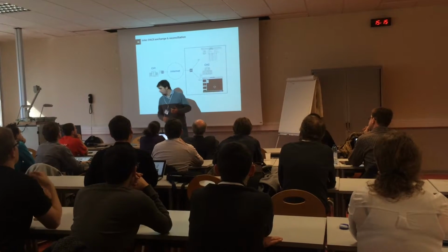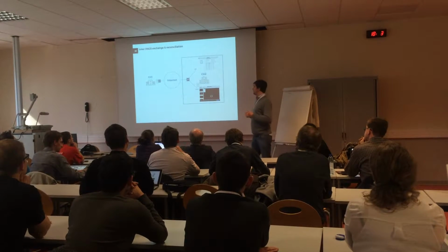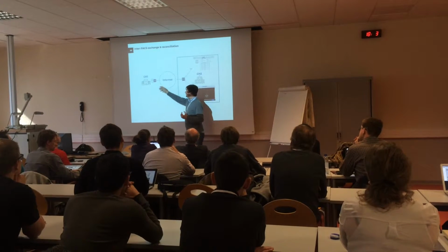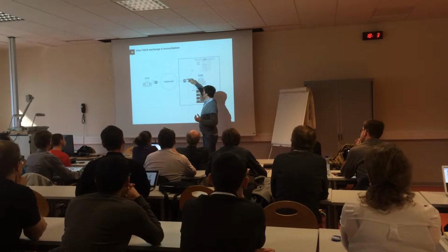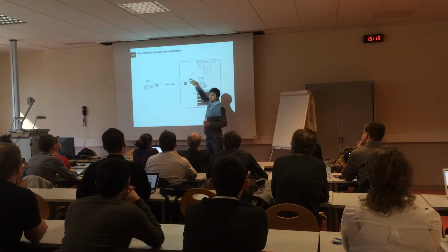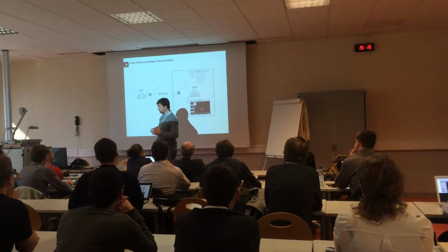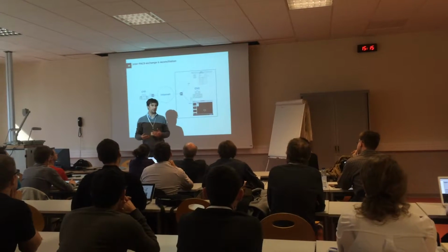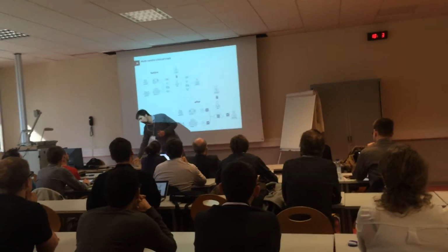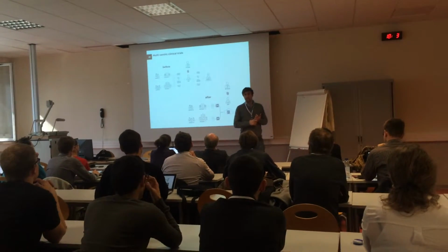This is an application where different hospitals have been interacting. So basically, Hospital A sends an image to Hospital B. There's a reconciliation tool, and then this stores data into the EHR and into the PACS. So this reconciliation is automated, but in case of exception, there's an interface that the user can use, and it's all custom built.